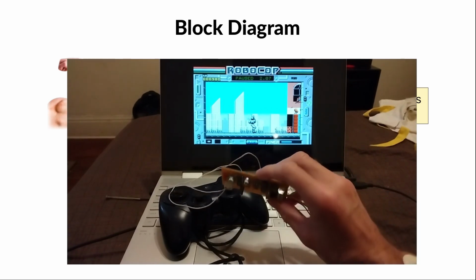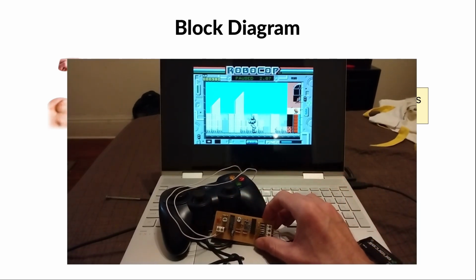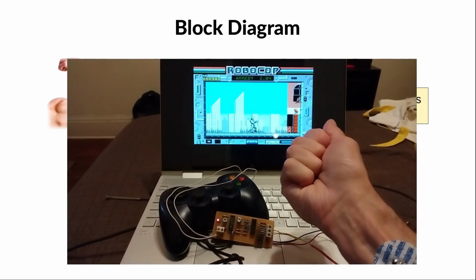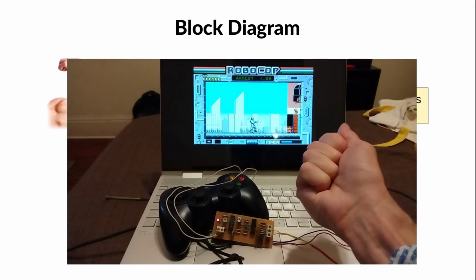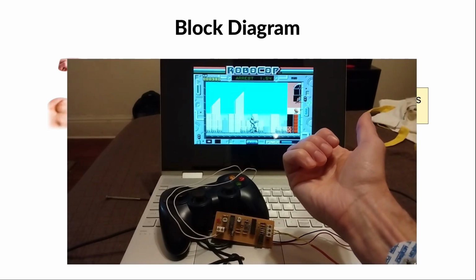Here I connected my circuit to my gamepad so that I can make Robocop shoot when I close my hand. Of course, we will need several circuits like this in order to make him walk and jump, but this is just a prototype that illustrates the possible applications.